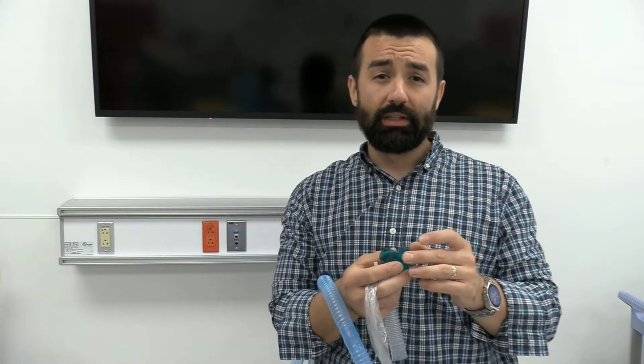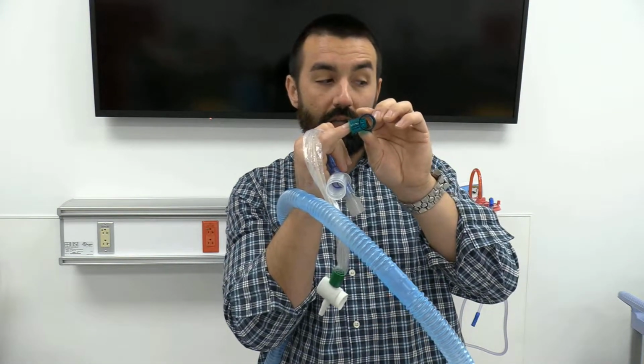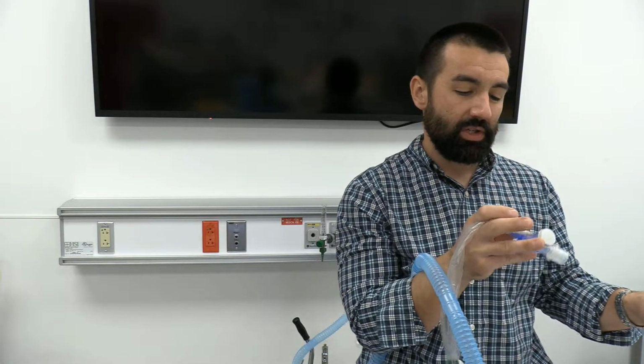Artificial airways, regardless of the size, most of the standard airways are going to have a 15 millimeter adapter. So a lot of the things that hook onto an artificial airway, we actually have the ability to have a 15 millimeter internal diameter here, so it hooks onto a tracheostomy tube. And I'll show you more about trachs in the next semester, so you don't have to worry about that stuff.